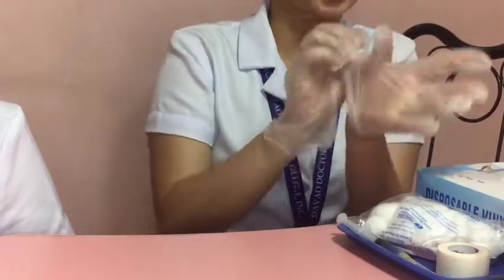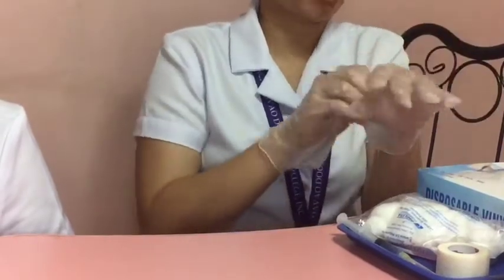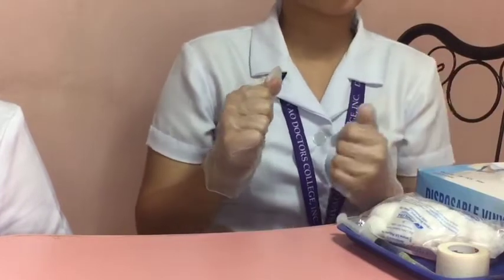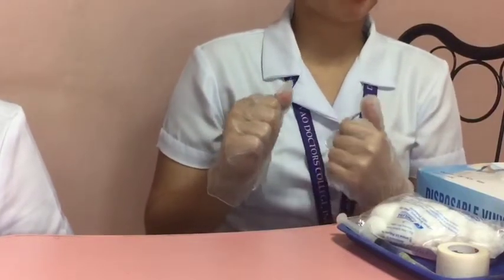So now, let's clean the site with an antiseptic swab. Using a circular motion, start at the center and move outward about 5 cm. Transfer and hold the swab between the third and fourth finger of your non-dominant hand in readiness for the needle withdrawal.